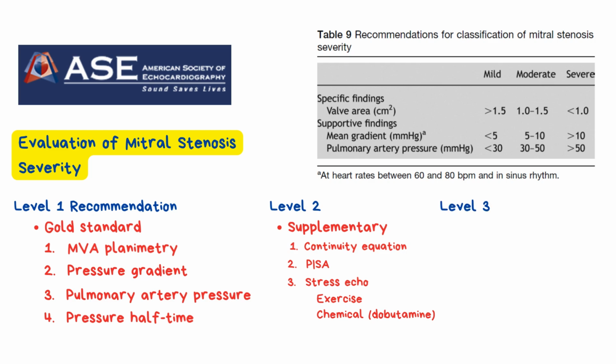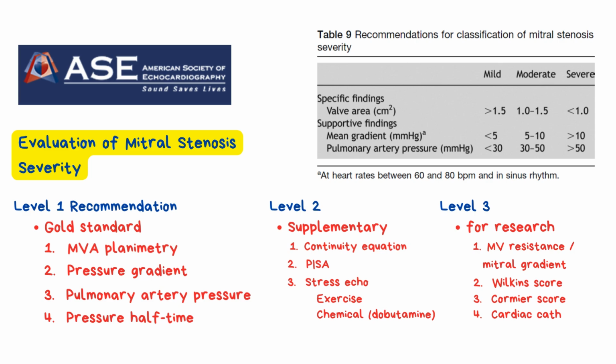Level 3 recommendations are not advised for routine clinical use. However, they may still play a role in research settings or rare clinical situations, especially when other imaging methods aren't available or are inconclusive. For example, cardiac catheterization is a Level 3 recommendation for assessing valve stenosis. It's not recommended as part of the routine workup unless transthoracic echocardiography, or TTE, is inconclusive or technically limited.